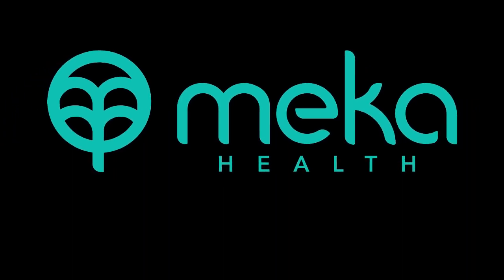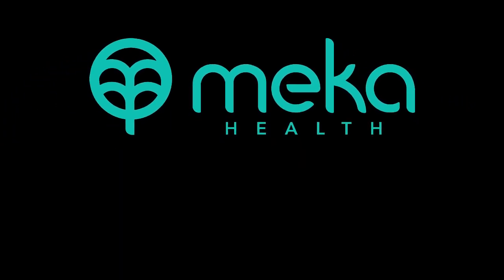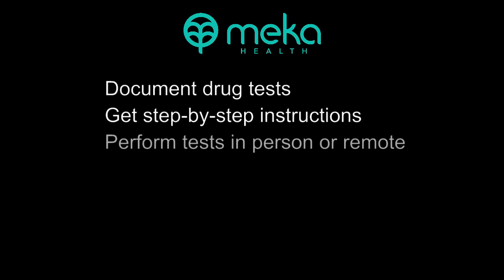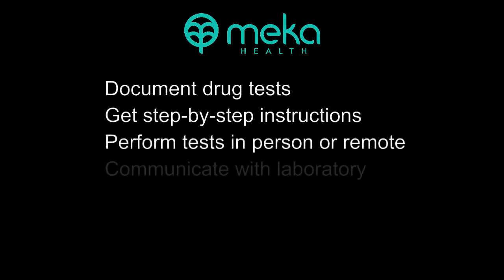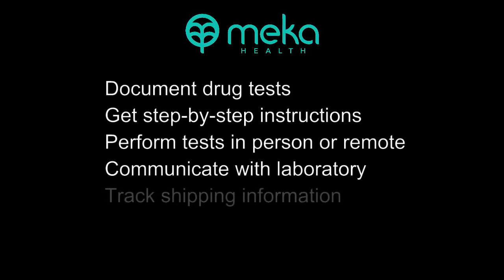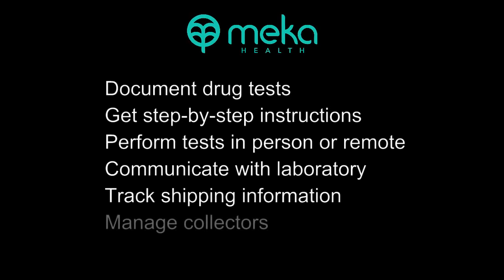The Meka testing application from Meka Health makes it easy for you to document drug tests that you administer to ensure proper chain of custody, get step-by-step instructions as you administer drug tests, perform in-person or remotely monitored testing, communicate test orders to the laboratory, track test shipping information, and manage collectors in your organization.